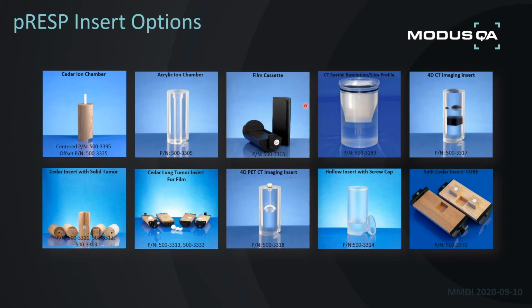We offer film cassette inserts where you can place a piece of film for film dosimetry. This one was originally designed for pre-EBT3 film where it was light sensitive, so that's why it's the dark color. But it is definitely useful for 2D dosimetry. We offer imaging quality inserts for your CT planning system. So this is a static insert that has spatial resolution features as well as slice profile.